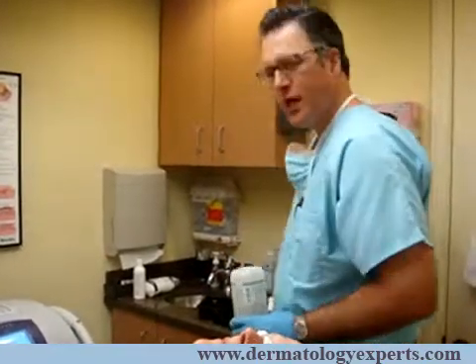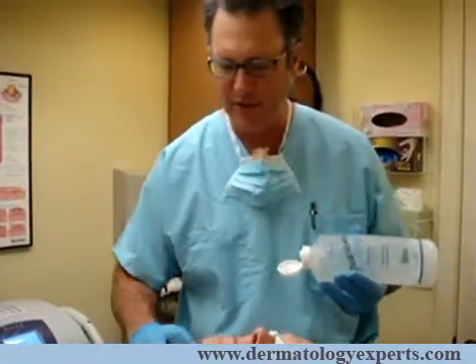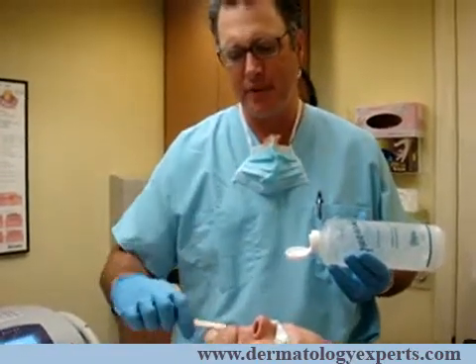We'll go ahead and first cool the skin with just a little bit of ultrasound gel — a small amount applied here to the chin area. This is the particular area we're treating today. This cools the temperature of the skin as well as the head of the laser and just makes the procedure safer.